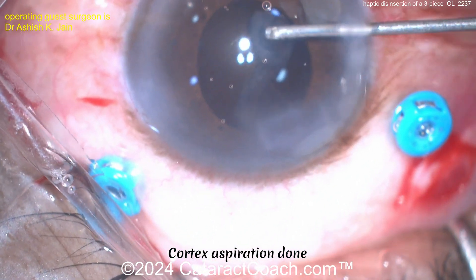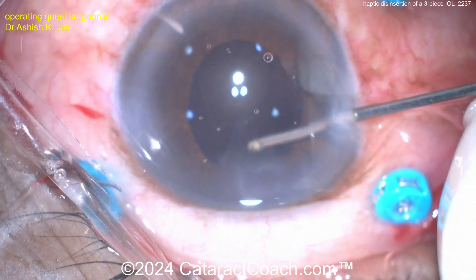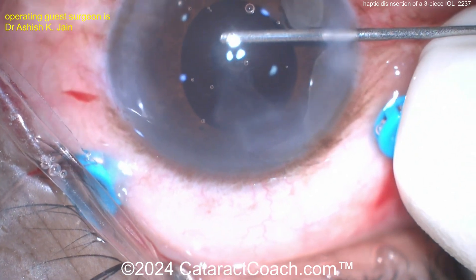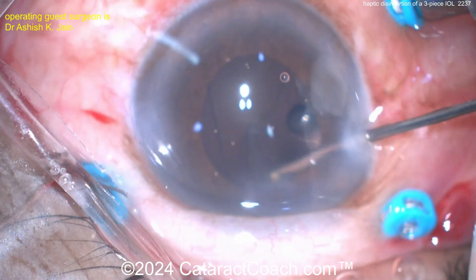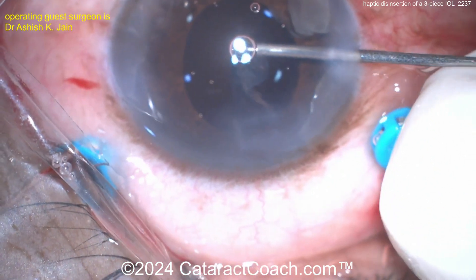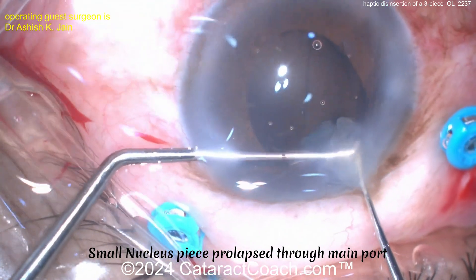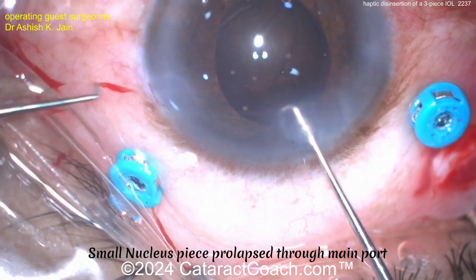You can use the same vitrector — just on your machine hit I/A mode or cortex mode to avoid engaging the cutter, because you don't want the vitreous cutter to damage the remaining part of the capsule, like the capsulorrhexis, since you want to be able to put your sulcus lens in and hopefully get some sort of optic capture. Taking out the cortex — there's still a chunk of nucleus there on the iris. There it is: a small nucleus piece prolapsed through the main port; you can definitely do it that way too.